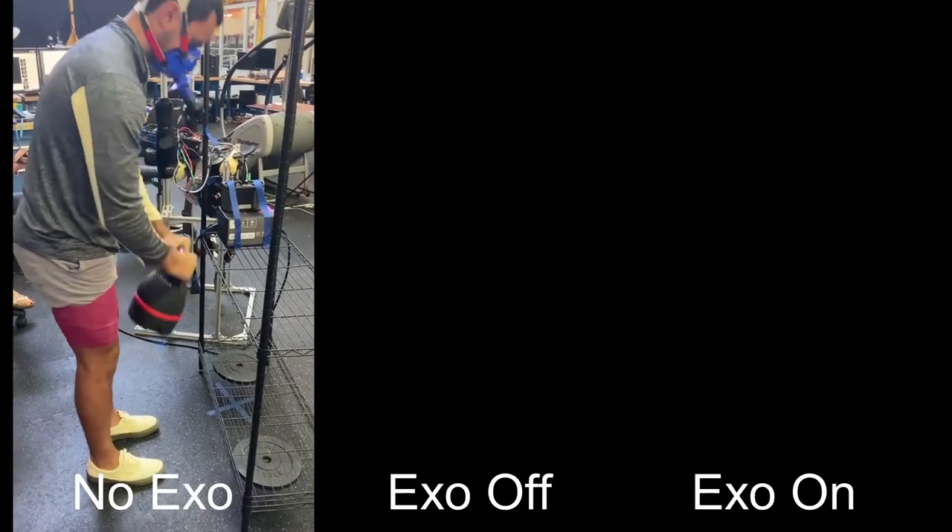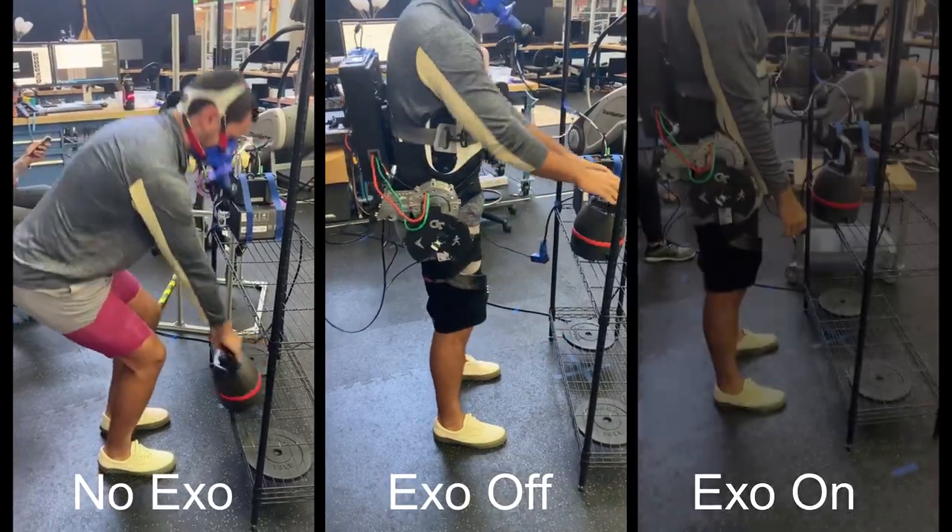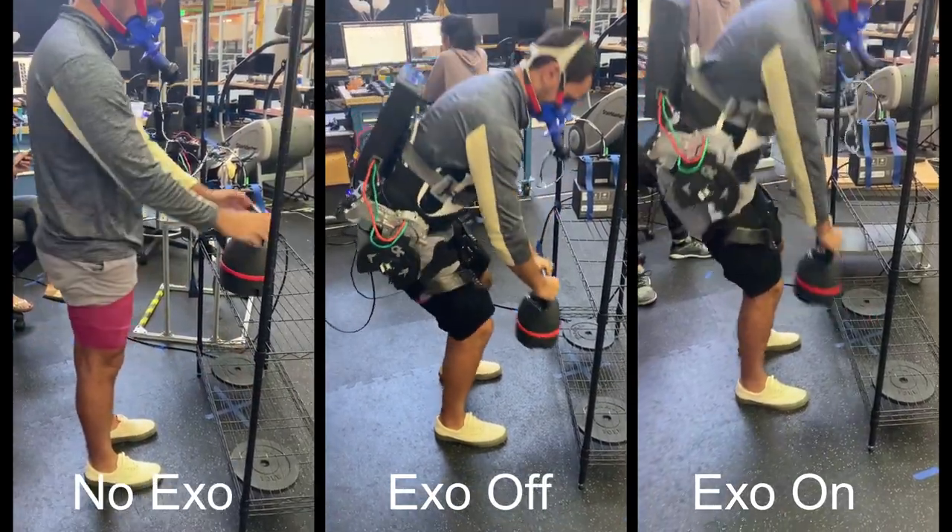Within each task, three conditions are compared: a no-exoskeleton condition, an exoskeleton powered-off condition, and an actively controlled exoskeleton condition.